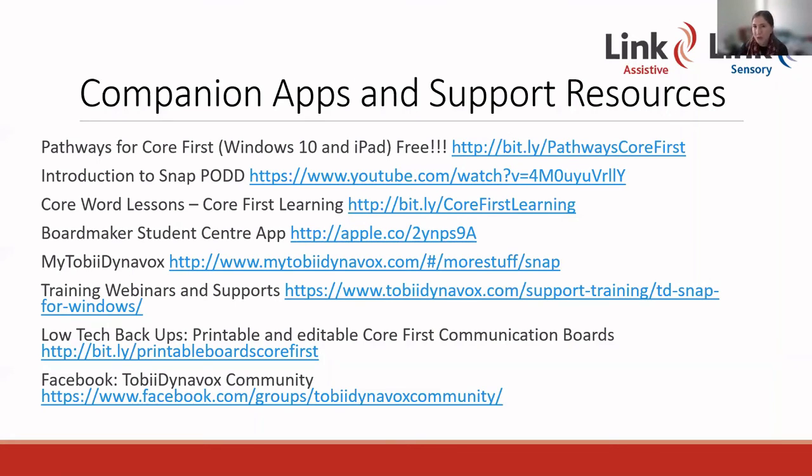There's Boardmaker Student Center app, which is very handy as well. My Tobii Dynavox, which I talked about quite a bit, will essentially show you how to set that up. And within that, there's some really handy tools for thinking about AAC assessment and putting some of those ideas together. Training webinars and supports, again, through the My Tobii Dynavox website. Some low-tech backups.